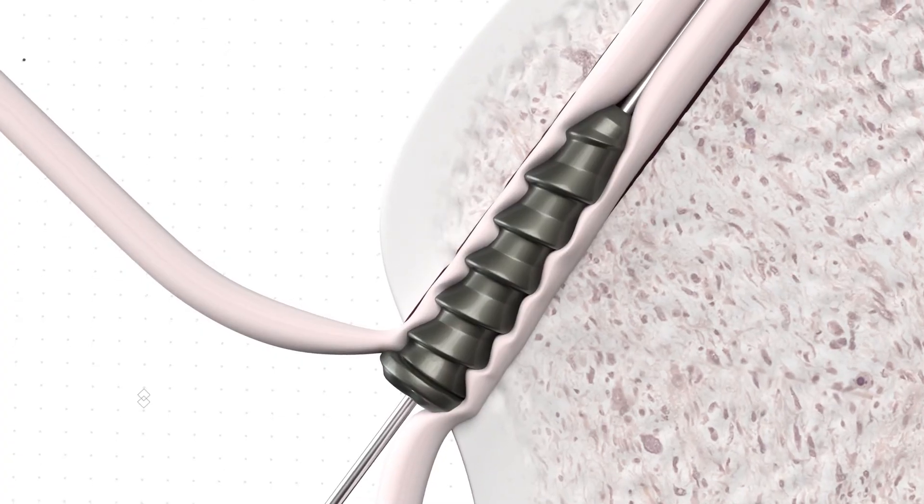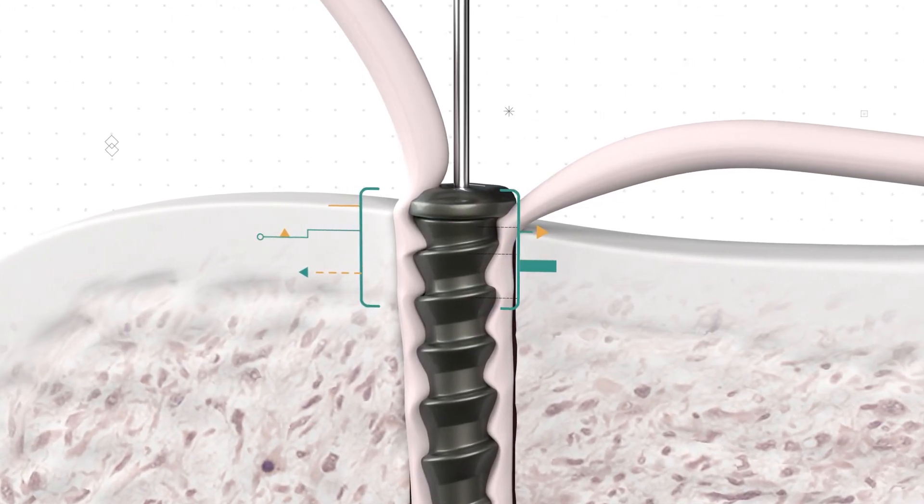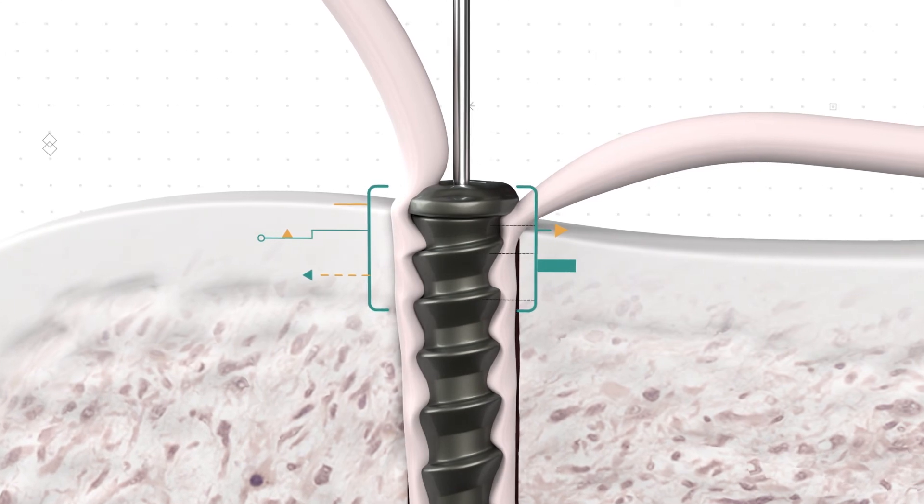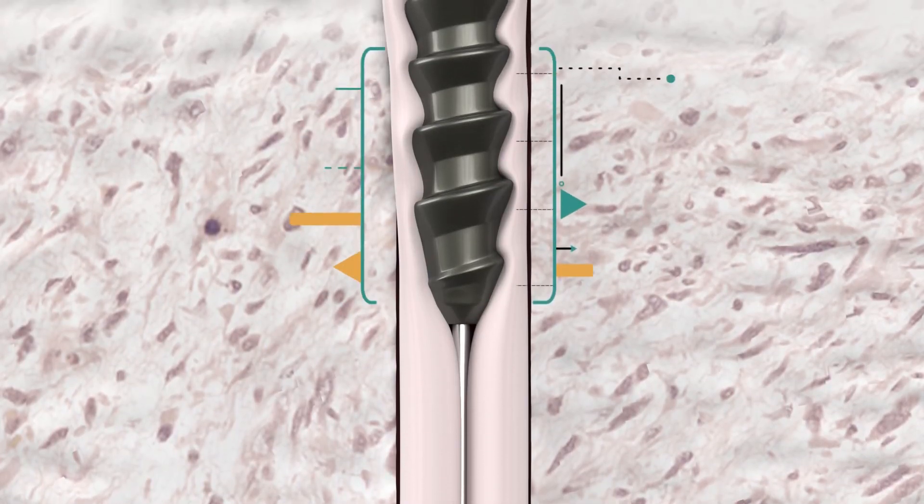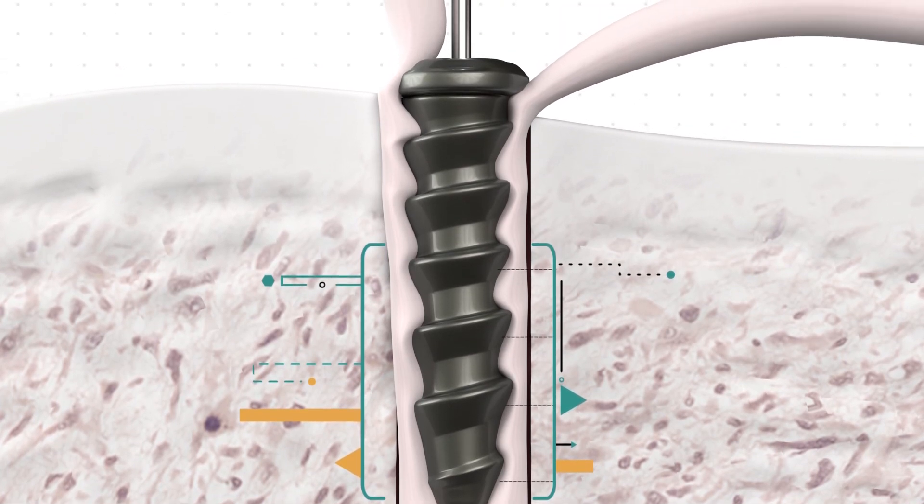Once the screw is secured, the higher number of threads towards the screw head offer maximum fixation strength around the hard cortical bone, while fewer threads towards the bottom firmly secures the graft and reduces damage to the soft, cancellous bone layer.